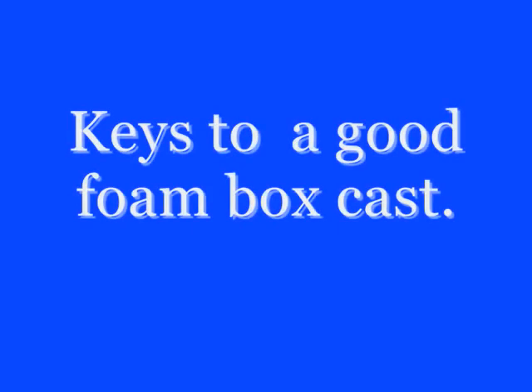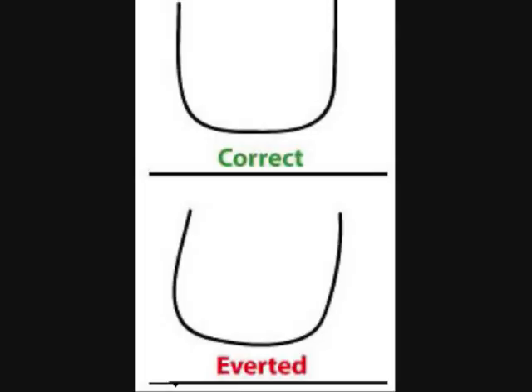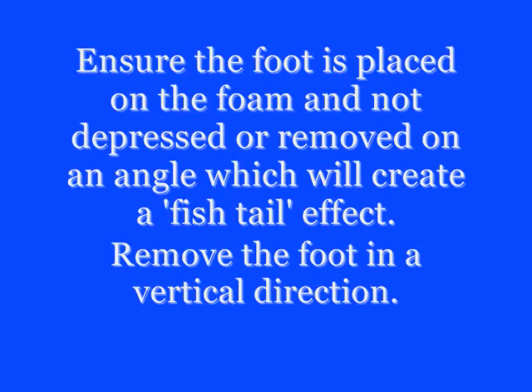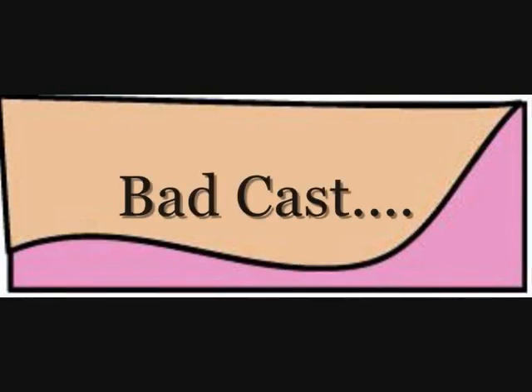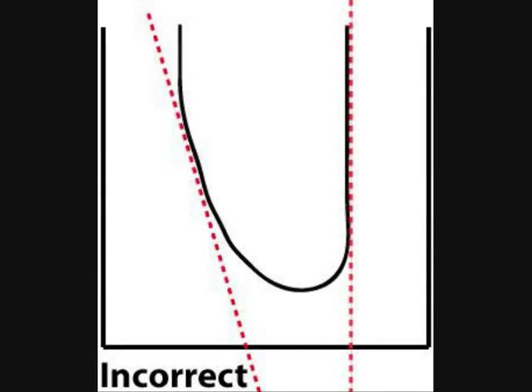Here are some keys to a good foam box cast. Check the feet are symmetrical and not excessively inverted or everted. When you cast the foot and remove the foot, remember to remove it vertically, not on an angle. A quick check of the heel shape will show you whether it's a good cast or a bad cast for the orthotic laboratory to work with.